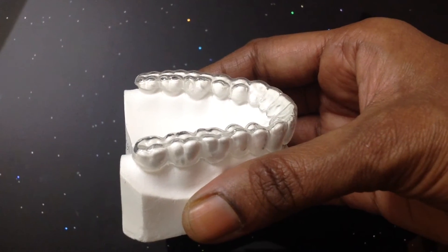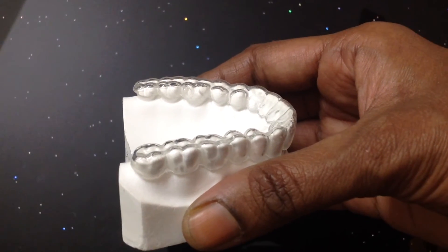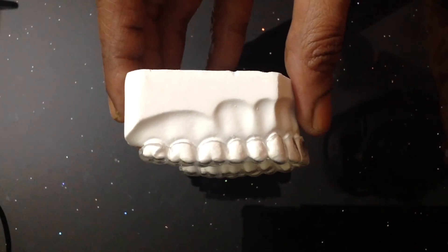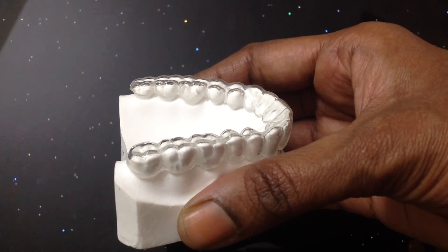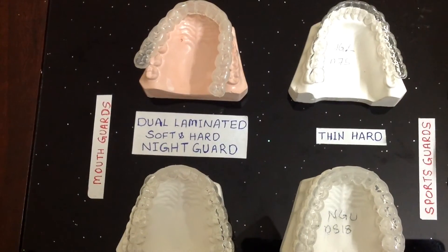Nightguards are worn either on the upper or lower arch. Most people prefer an upper guard over a lower guard, as it comes in less contact with the tongue and is easier to remove. Some patients find it easier to sleep with the lower guard. Both provide the same level of protection — it is only a matter of individual preference.